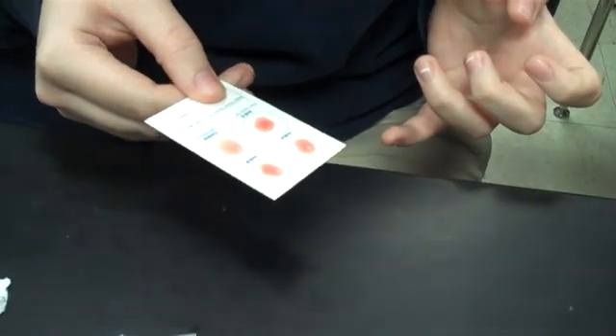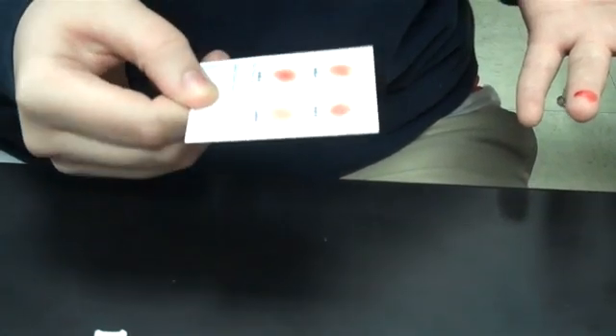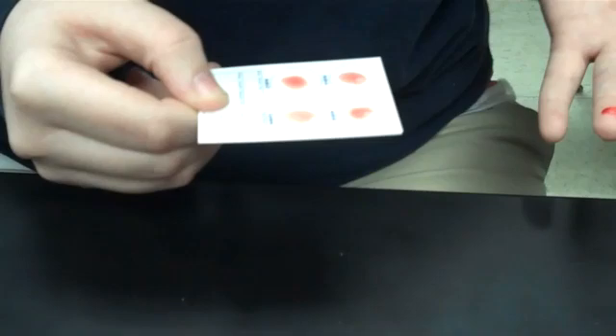Just tilt it back and forth slowly, kind of let it roll. Just let it do that for a few minutes. You might start to see it thicken or clump on one of the circles, which would indicate that that's what your blood type is.